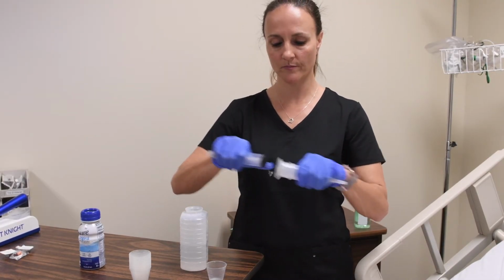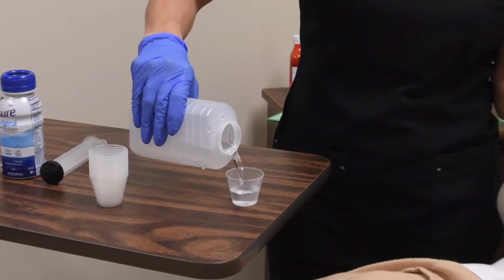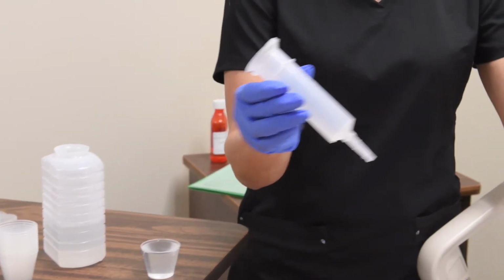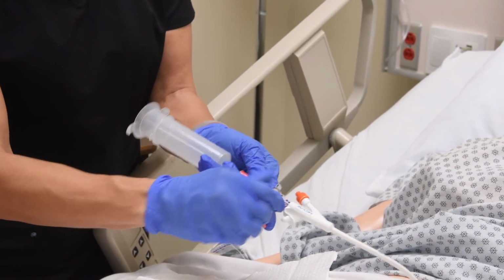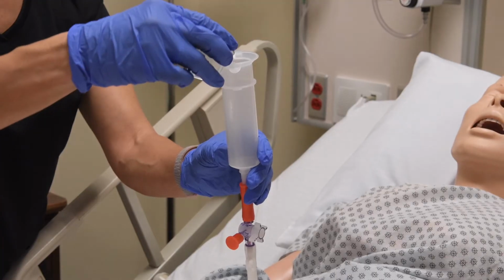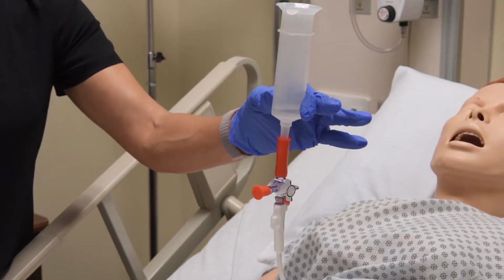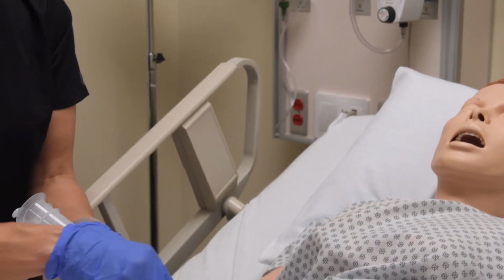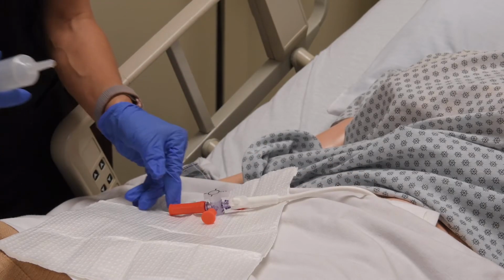Remove your plunger. It's a little bit easier if you go ahead and get your medicine cup and fill it all the way, which is 30 mLs. Now I'm going to get my syringe and I'm going to attach it to the PEG tube. Turn it to the on position and pour my water, and allow it to go by gravity. Then I'm going to turn it back off and get ready to administer my feedings.